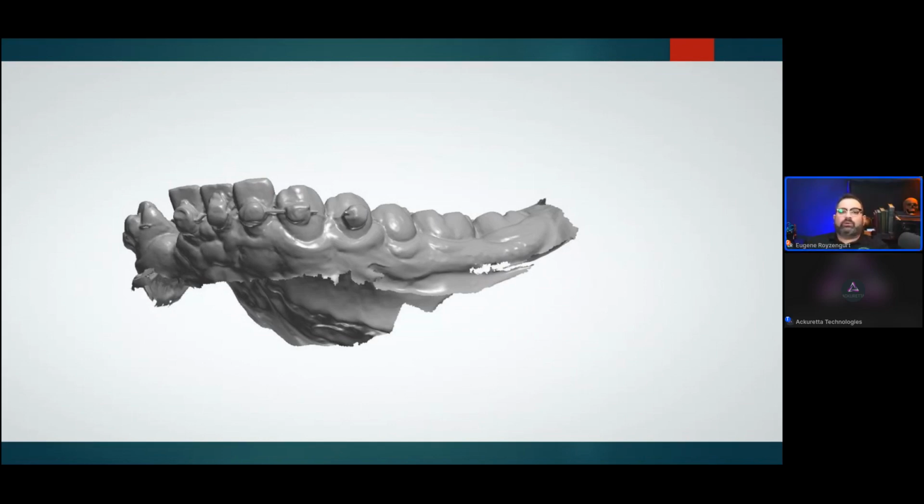Okay, so you won't have any issues if FDA ever comes knocking. Because if you're changing out your protocols, like say, for example, I want to use this printer, this curing unit for this, and this washing station for this, somewhere along the line I might not be doing something as a verified protocol. Now, if you're doing a dental model, it's not a big deal. Nobody cares because it doesn't go inside the mouth. But if you're putting something inside the patient's mouth, you need to have a validated system.